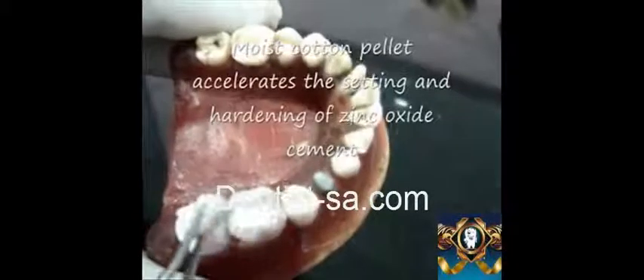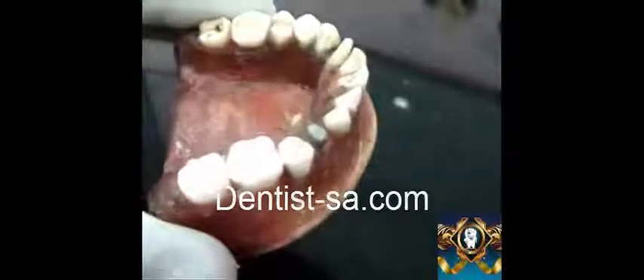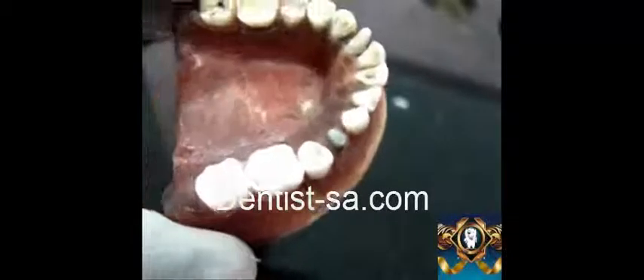The water or moisture content in the cotton accelerates the setting reaction of zinc oxide eugenol and provides a quickened, hardened mass. All the rest of the tooth surface is cleaned up with the same moist cotton pellet. This will be the finished temporary restoration with the calcium hydroxide liner, and this restoration is replaced after 15 days.